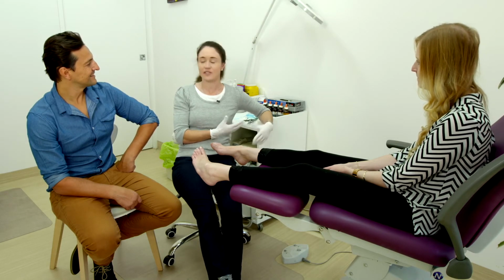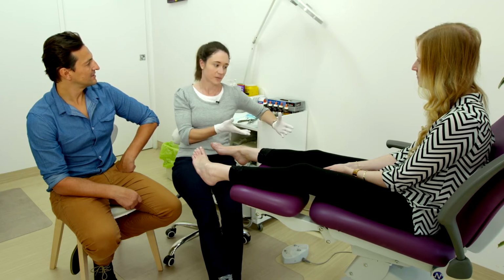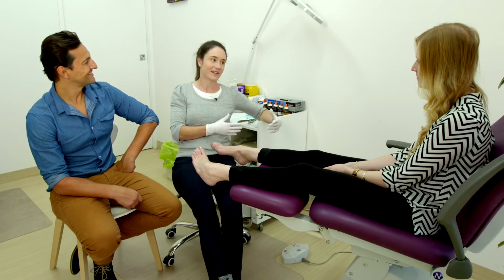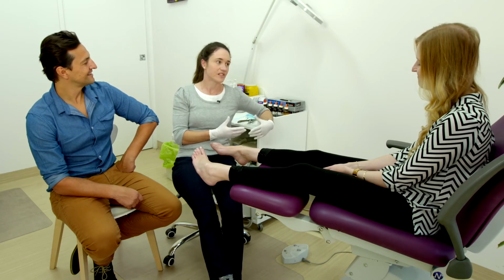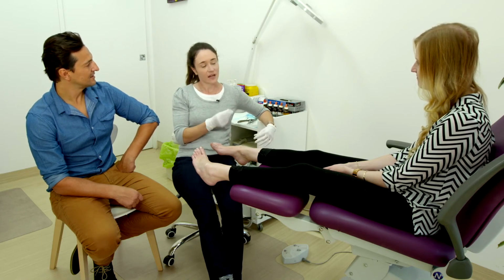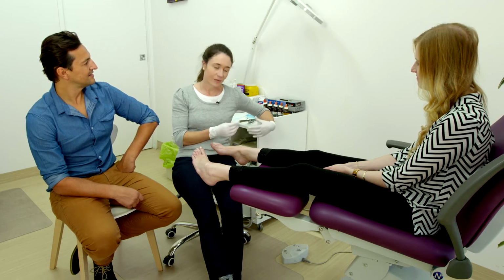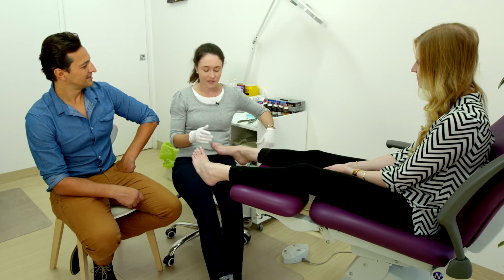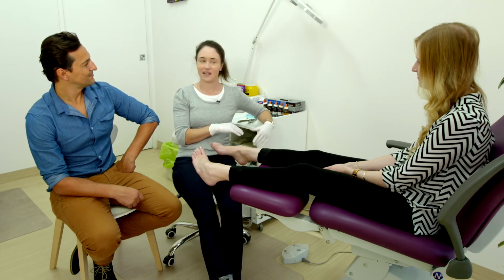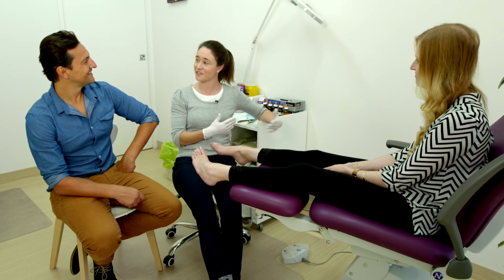As far as a partial nail avulsion is concerned, it's quite a simple surgical procedure that's performed in the patient chair. I normally get my patient laid back and comfortable, explain the whole situation so they're aware of what we'll be performing. They get a local anaesthetic to the toe to numb the whole toe, and then we go in and take part of the nail. I always make sure the patient's quite happy with the amount that we're taking, because young females in particular can be concerned about the cosmetic appearance.